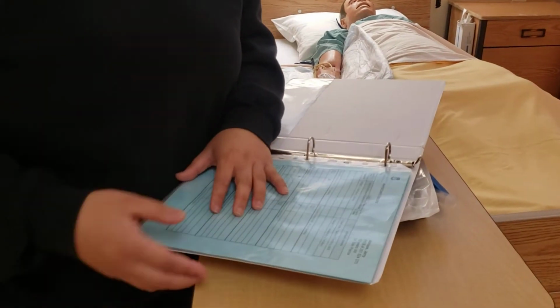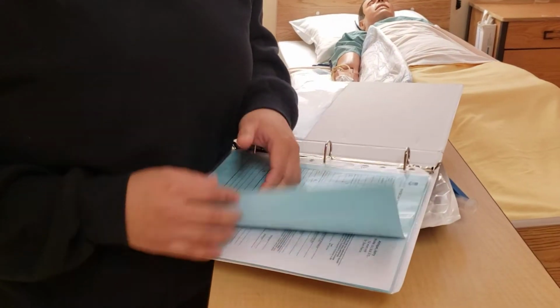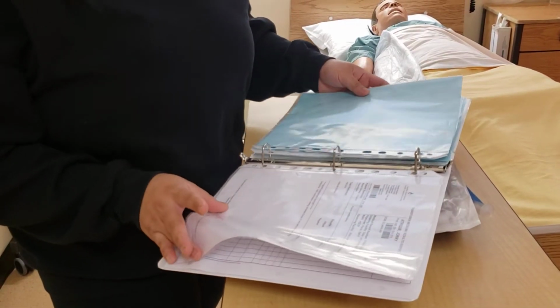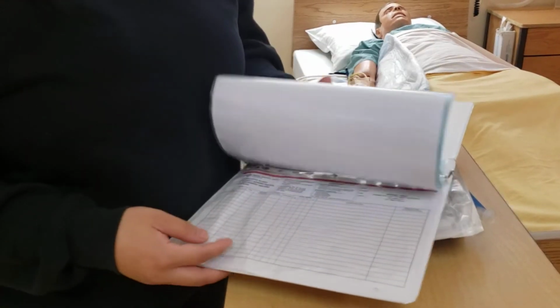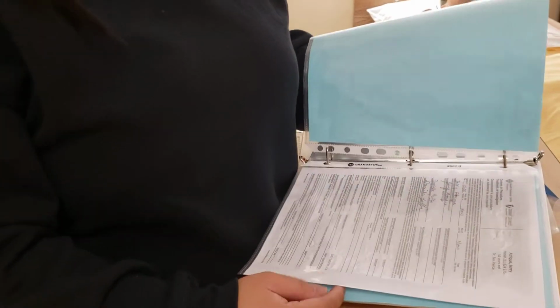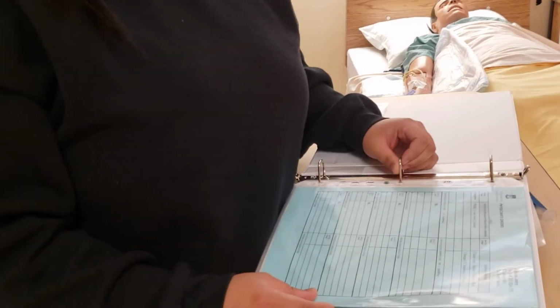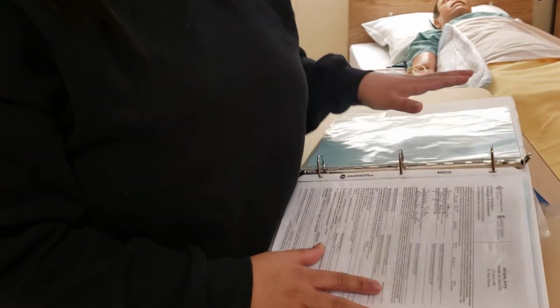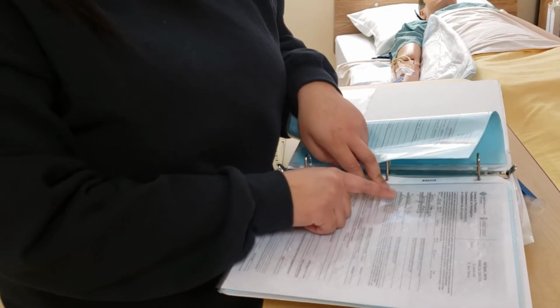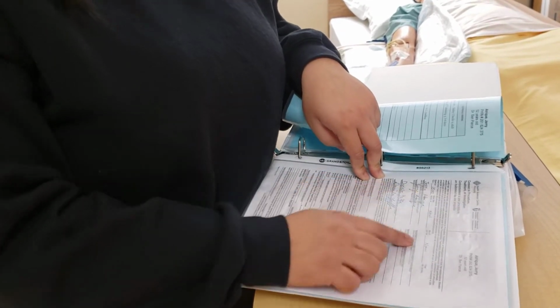We can also look at our patient's chart for the reason why the blood product is being ordered. There's no reason here, but we will say that the reason that the patient is receiving blood is due to low hemoglobin levels. So next thing that I want to do is check that I have the signed consent form. So we want to check the patient's name, their signature, and then the doctor has signed also the consent form, and then we want to make sure that it is up to date.